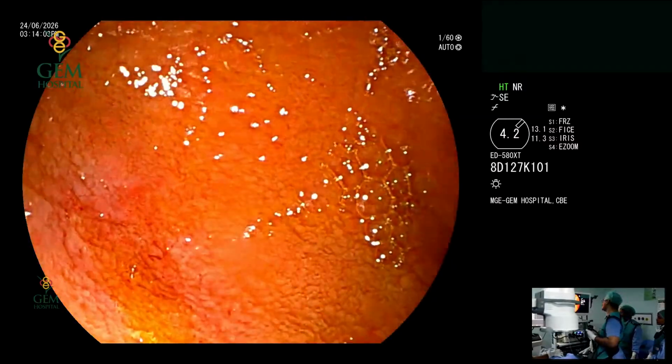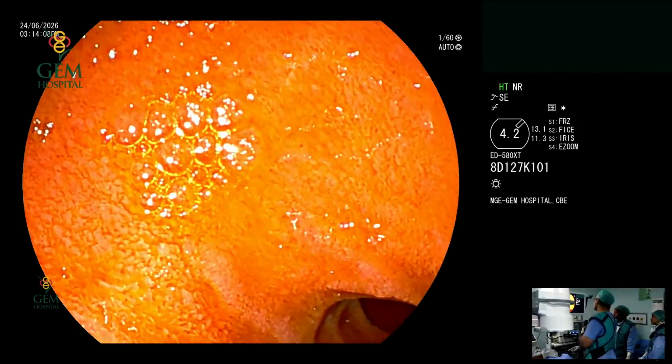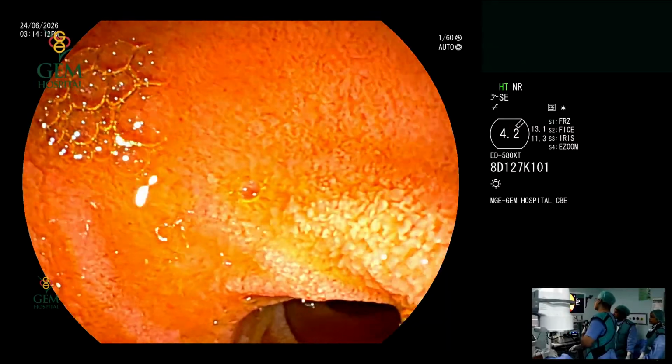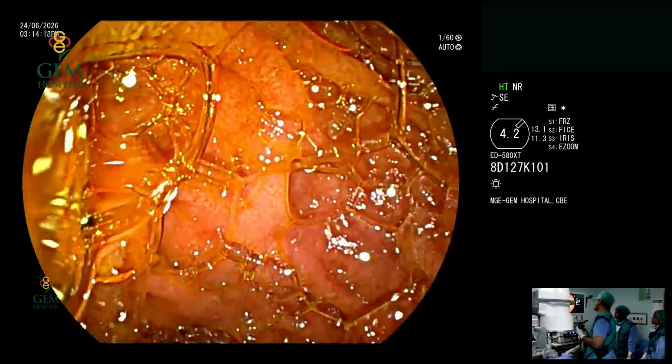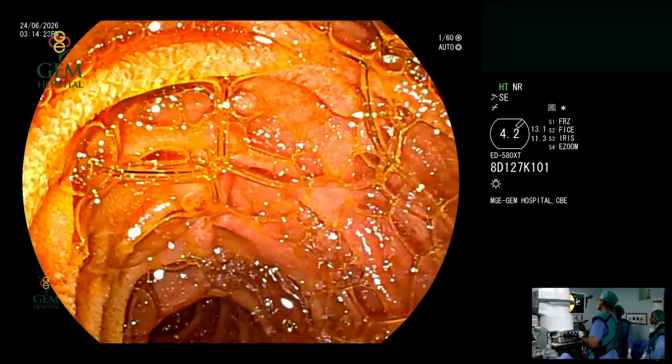And you can clearly see, as you curve the scope right, and ERCP is to be performed with your entire body. You cannot be stiff. And as you glide the scope across the D1, D2 junction and you enter the D2, you can see the duodenal folds very well. You can see the amount of bile with the bubbles very, very clear.